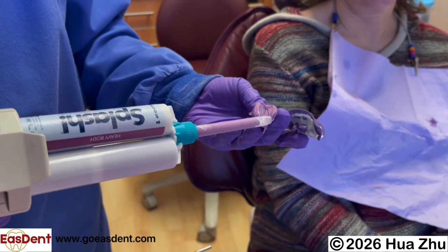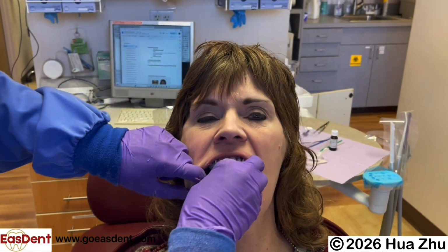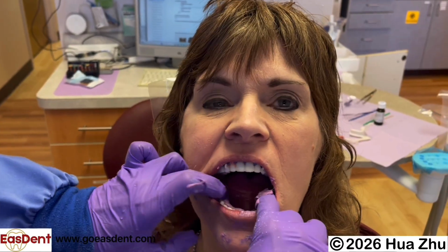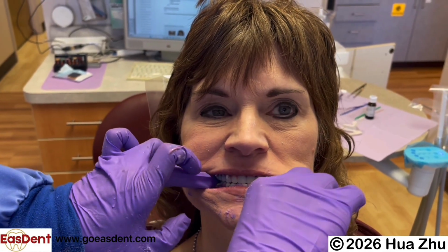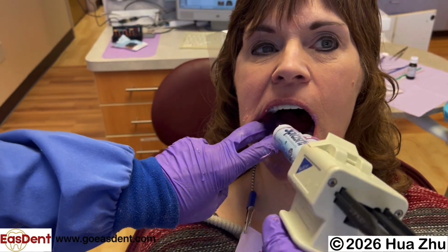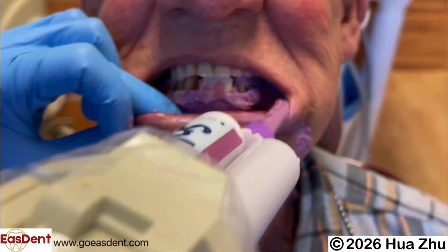Load the material at the border. Do one side at a time. Seat the tray completely in the mouth. Press the tray hard to make sure the tray is seated correctly. Guide the patient to bite in centric relation until maxillary and mandibular Easdent teeth are in contact to verify the seating. Check the border. If anywhere is still short, load additional material.